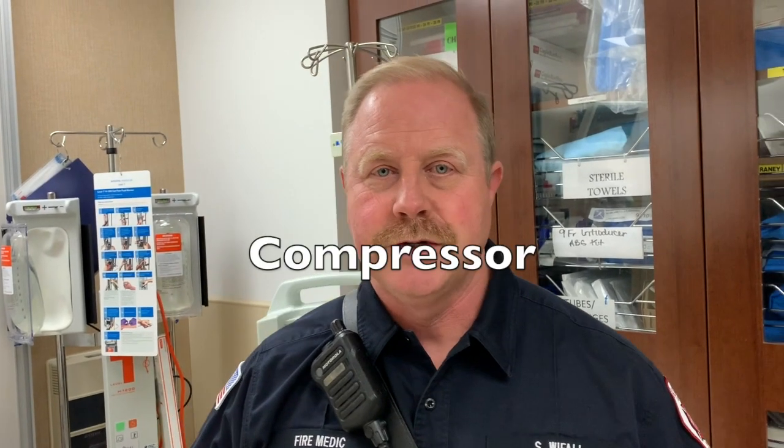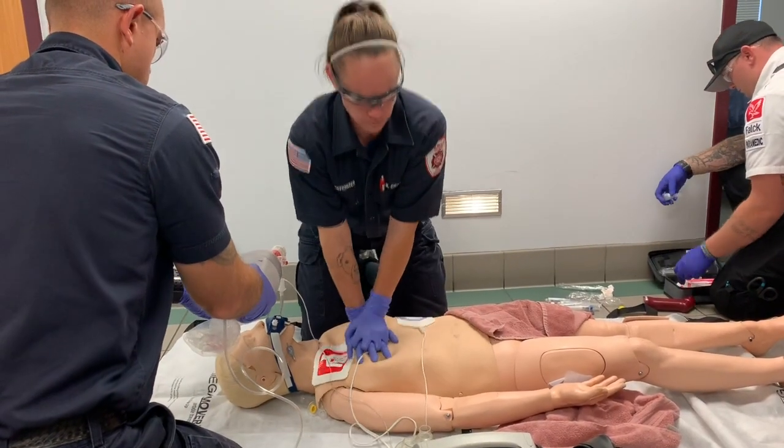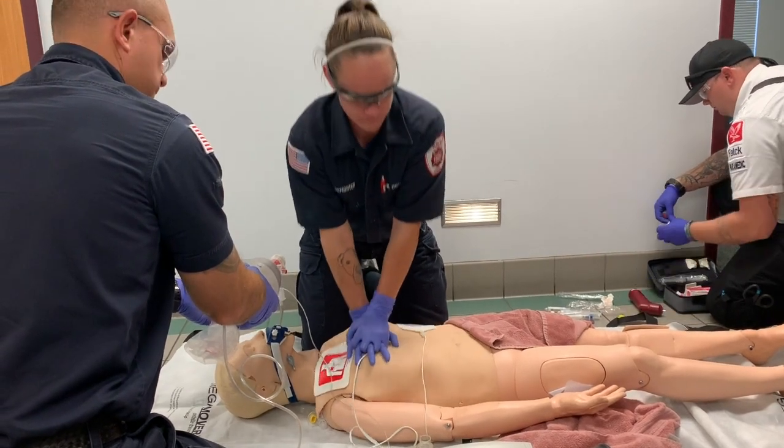The role of the compressor initially would be to start high quality CPR, pushing fast, pushing hard, allowing for a full recoil, and not waiting for the combo pads to be applied. Once the combo pads are applied, the compressor would continue CPR, watching the CPR channel.